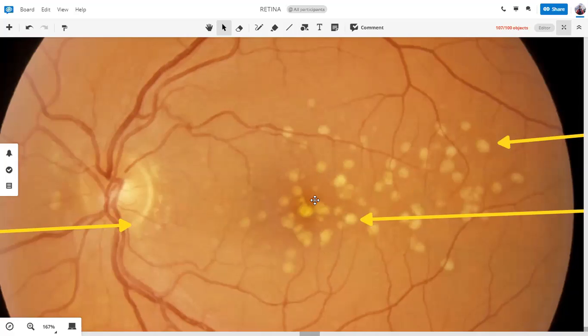The vessels are normal. Okay, and that is a very good thing that we will use to differentiate. Vessels are normal. We know that vessel leakage causes exudates, but we cannot see the capillaries properly. The leakage is from the capillary. In this picture we cannot check mobility either. What else can we see? Absolutely, the margins are well defined, one important thing.